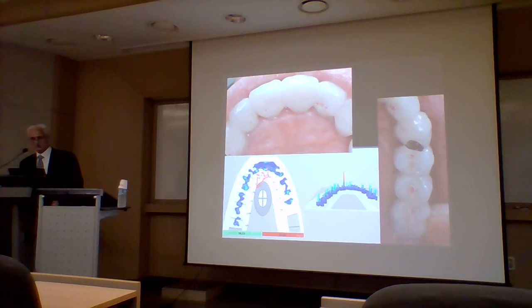So going through the process later, where everything is pretty moderated force-wise, there's only one remaining forceful contact in the anterior, and that's the distal of the 2-1. The other contacts are all similar and well distributed, but we found one very high contact on the inside of tooth 21. But again, without the T-scan, it might be thought that the lateral was forceful, or this premolar was forceful, but you can see they're very low force, and here's very high force, much smaller mark.